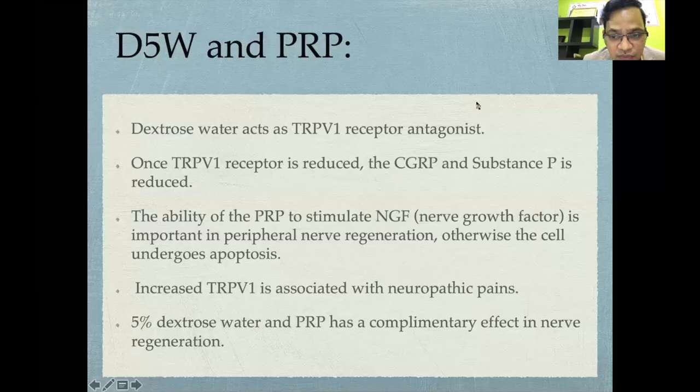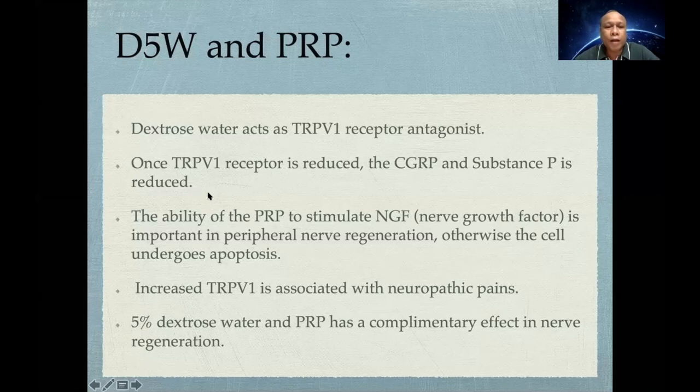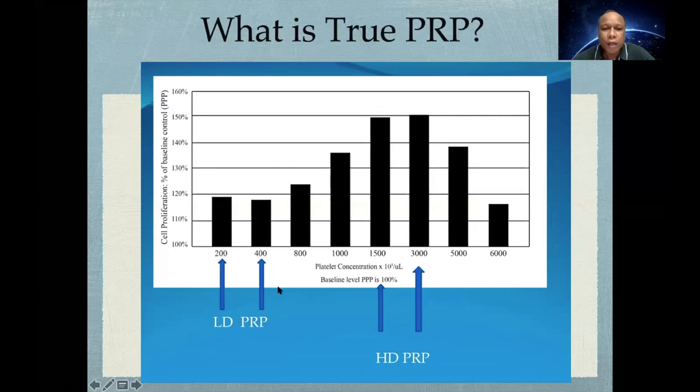So now here, this is a peripheral nerve hydrodissection using PRP under ultrasound guidance. There are different types of PRP. Of course, we have the low density type, we have the high density type, and depending on the target, we choose which one we're using. For the purpose of the nerve, we would prefer the low density type instead of the high density because of a lot of pain with the high density type.